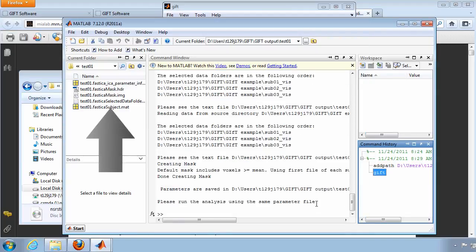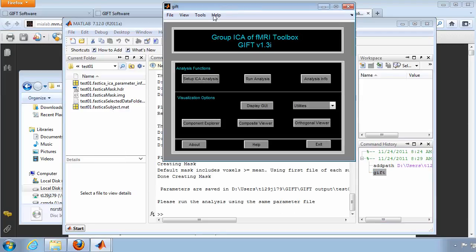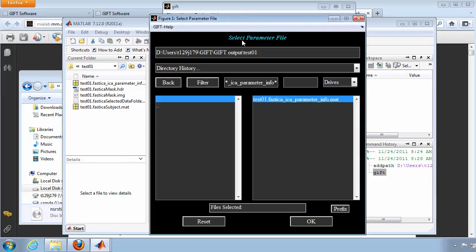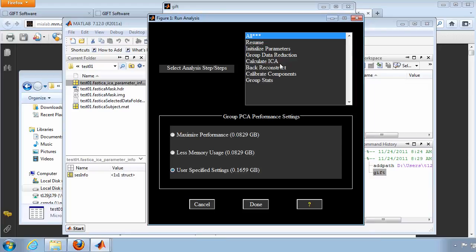Notice that in MATLAB, the output folder has been populated by MATLAB files, which are created for you during this process. So the correct parameter file should be visible when that window appears, so you merely need to select this file for the analysis. However, if you ever need to re-run an analysis, you can jump straight to this step and select the appropriate past file by clicking Run Analysis when GIFT first opens.